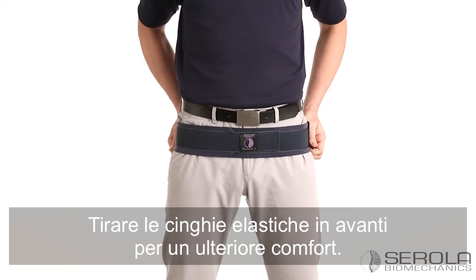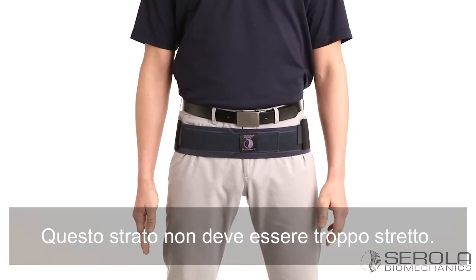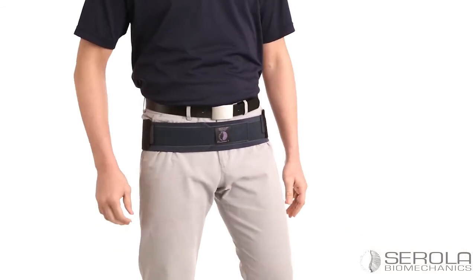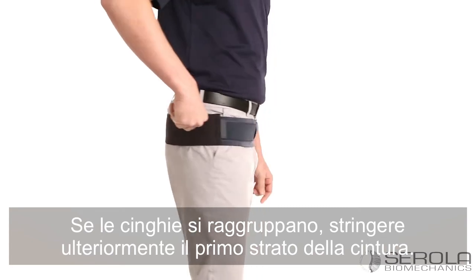Pull the elastic straps toward the front for comfort. This layer should not be too tight. If bunching occurs, tighten the first layer of the belt further.